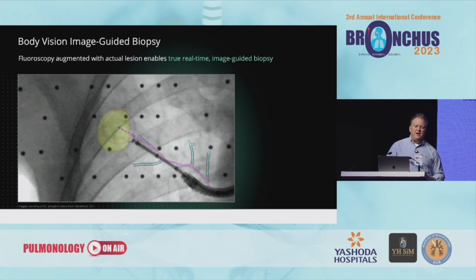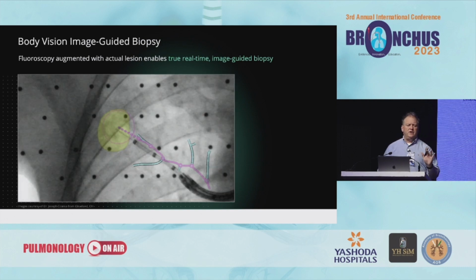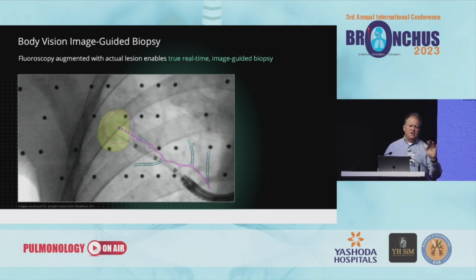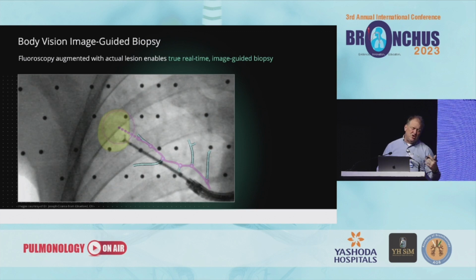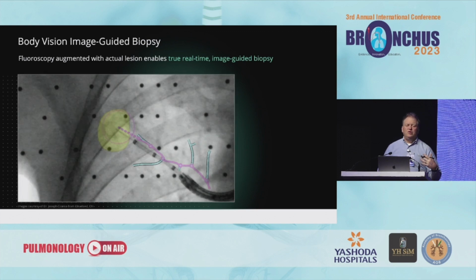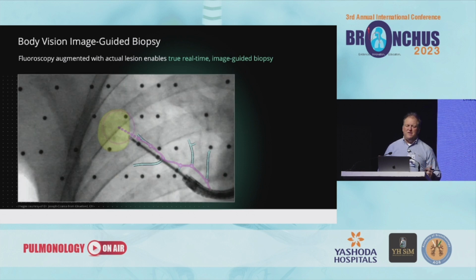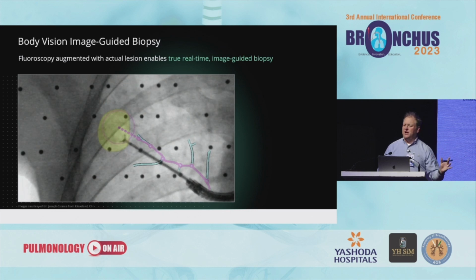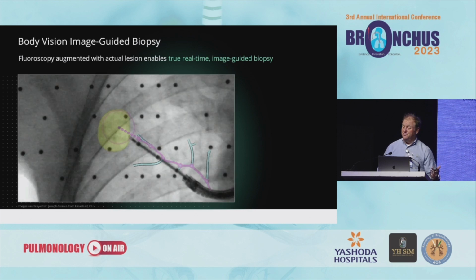Taking a straw poll of many different endoscopists, I've asked: if you have no confidence of where you really are, there's been CT to body divergence, you haven't had a good radial signal, you think you're at the lesion but you're not confident, how aggressive are your biopsies? Generally speaking, everyone has agreed with me that we're definitely a little softer in our approach, because we're not confident we're even going to get an answer, and we're pretty confident that we're going to cause a complication. And the worst complication is no diagnosis.